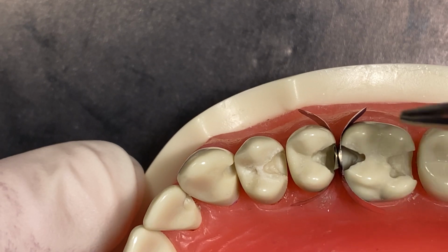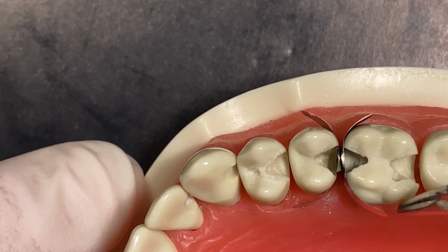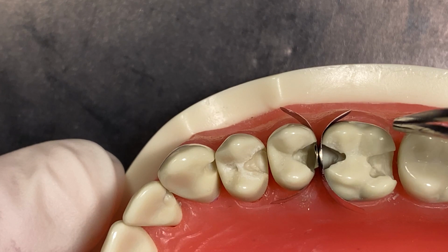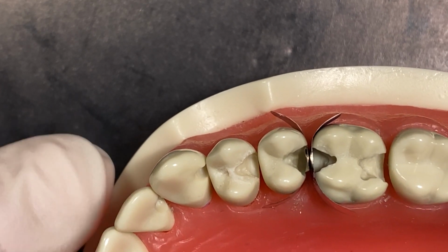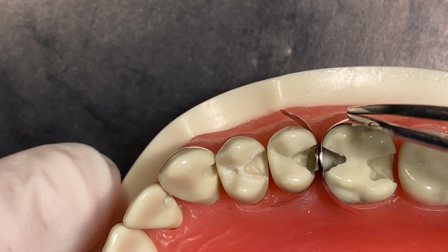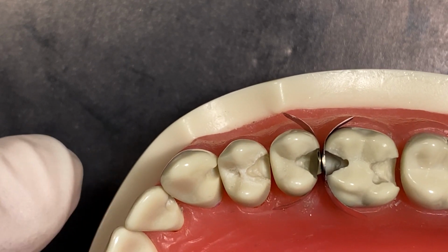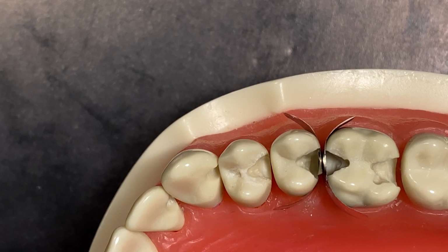sectional matrix. I do a lot of trimming of my sectional matrix bands to help reduce the amount of interference in these areas. But if you're having trouble placing MOD sectionals, you're not alone, as it can be quite cumbersome. And if you don't identify the fact that these can interfere with one another after the ring is placed and really dislodge, mess things up for you when you least expect it, just something to keep a lookout for.